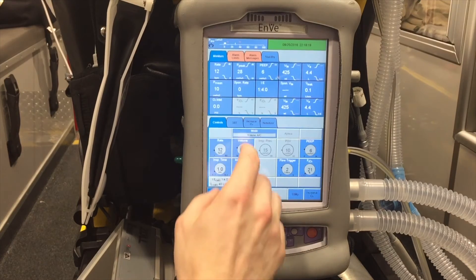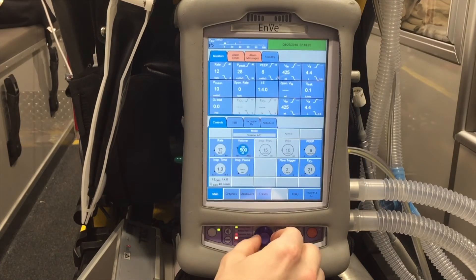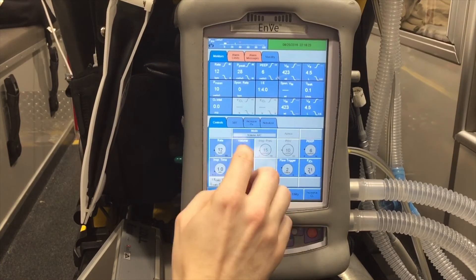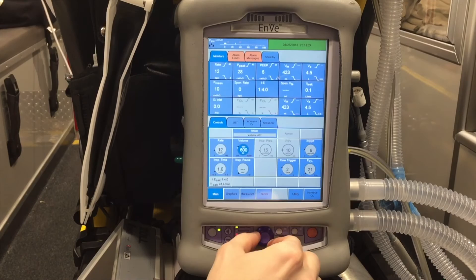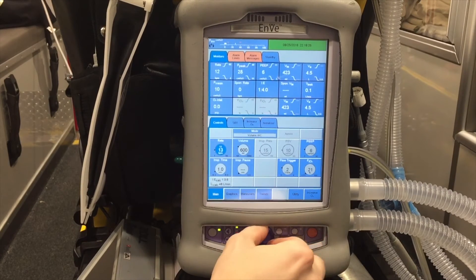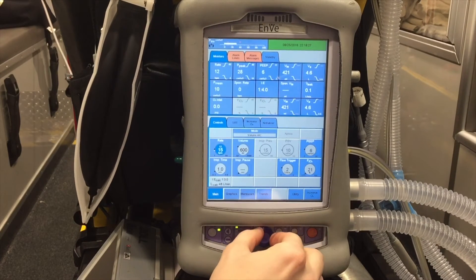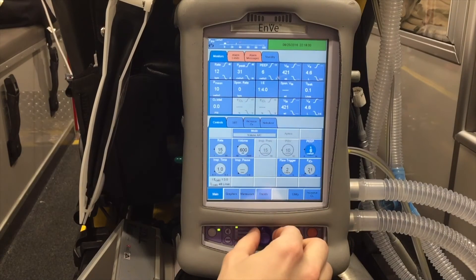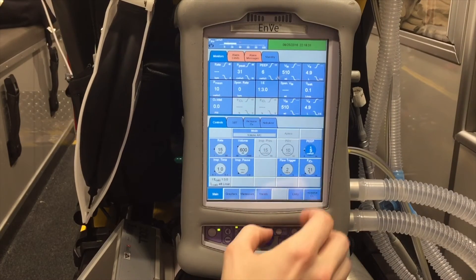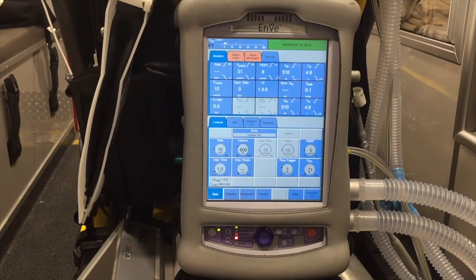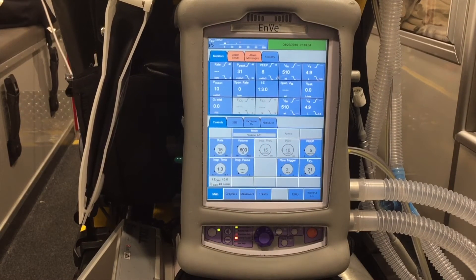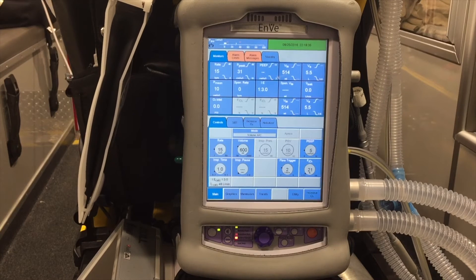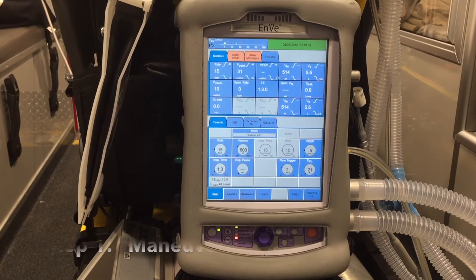Now that our ventilator is on, we'll go ahead and punch in some settings. We'll set a tidal volume of 600, a rate of 15, and a PEEP of 5. Now that we have our settings in, we can connect to our patient, and once we're connected we can check a plateau pressure.